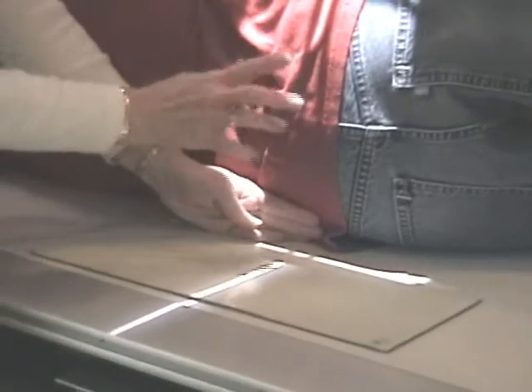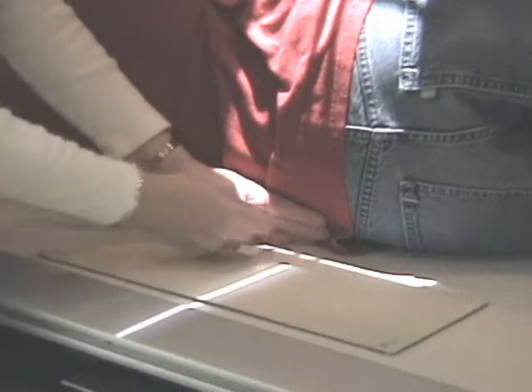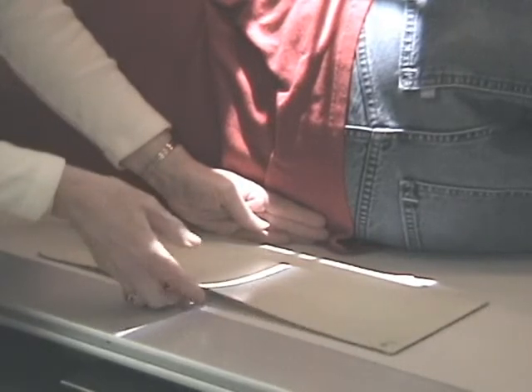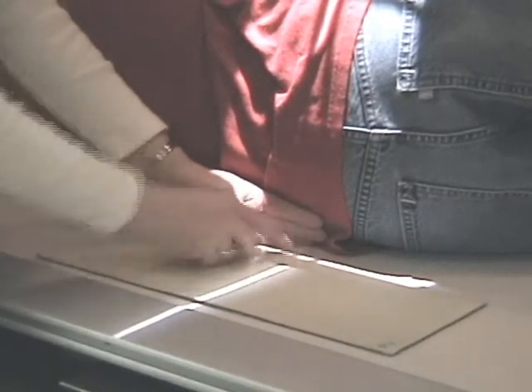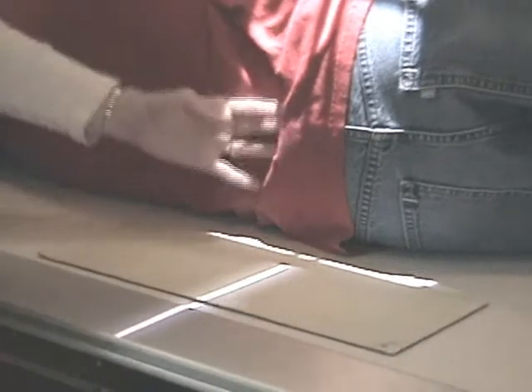Bring your lead blocker in to the field, but not into the shadow, because there's not a lot of adipose tissue back here on this patient. So we don't want to put this lead blocker into the shadow. Somebody who's 300 pounds, this strip could go into the shadow a little bit because they have a lot more adipose buildup.